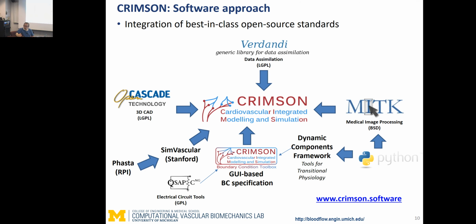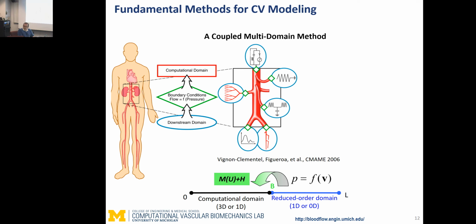So let me just demonstrate the Agile boundary condition editor. But the one thing about blood flow modeling, so this is a theory slide, if you want, is explained in this picture here. When you do image-based modeling, obviously you rely on having some image data for the patient. Inevitably, it's going to stop at some point, or even if it was full body, like the one I showed you, at some point you're not going to see the vessels. So whenever your three-dimensional model, which is this red cartoon here, ends, you are artificially truncating the vasculature there. Obviously, the vasculature continues, you just don't see it.